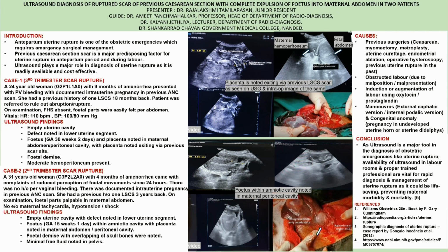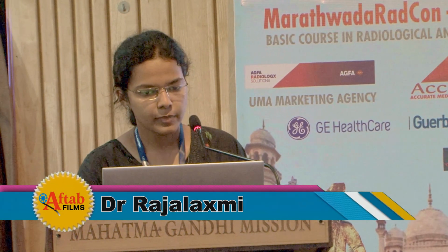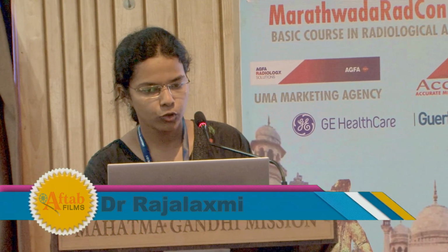I am Dr. Rajalaxmi from GMC Nanded. My guides are Dr. Amit sir and Dr. Kalyani ma'am. My topic is ultrasound diagnosis of ruptured scar of previous Caesarean section with complete expulsion of fetus into maternal abdomen in 2 patients.